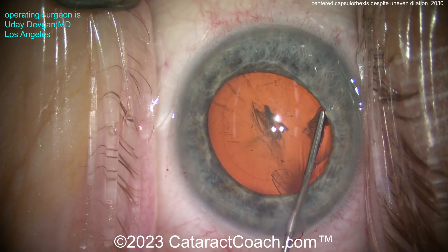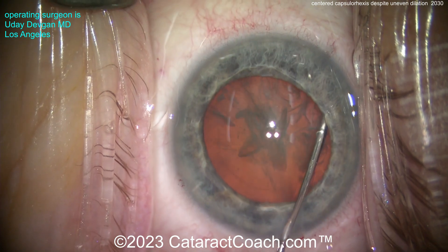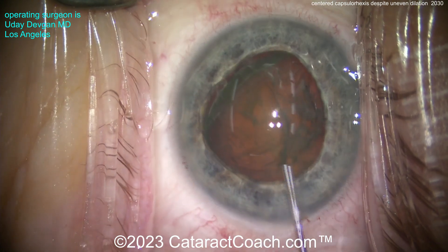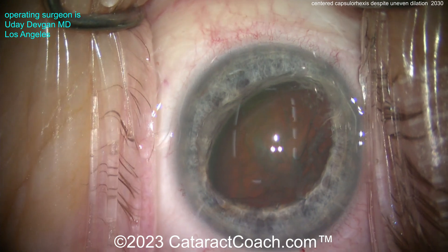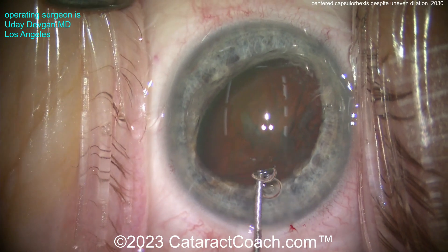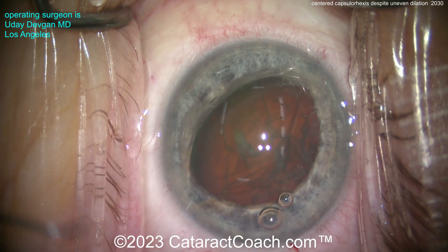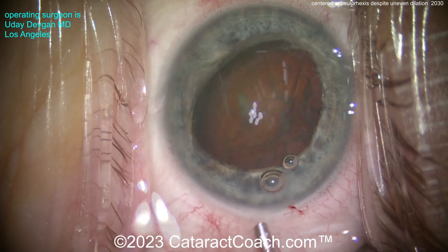But look at the dilation now — it's a little asymmetric. So we'll do some hydrodissection here to get that nucleus separated from the lens capsule. There we go. We'll prolapse it out. Not too dense of a cataract, so we'll get that lifted up out of the capsule bag. Notice how I lift it up a little bit extra so it doesn't fall back in. A small aliquot of viscoelastic there to protect the corneal endothelium. Here comes the phaco probe, 2.2 pink sleeve going inside the eye.